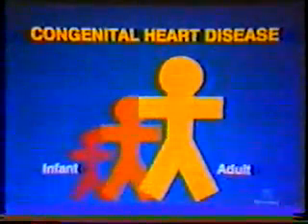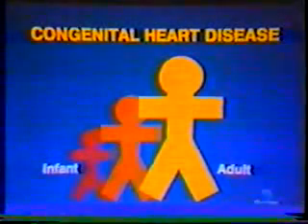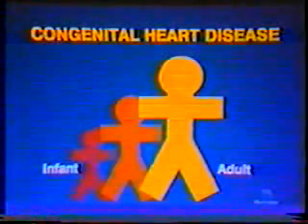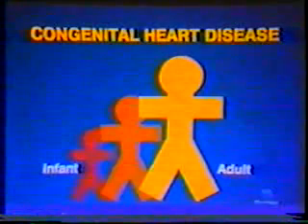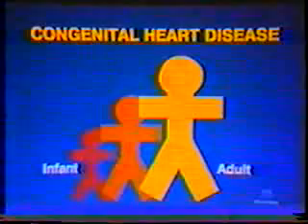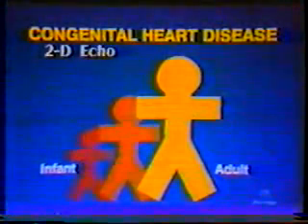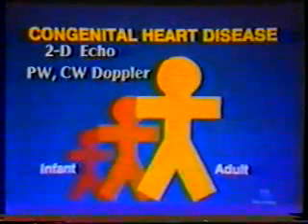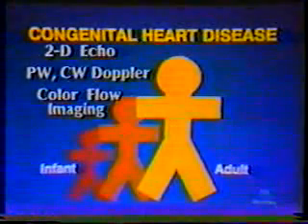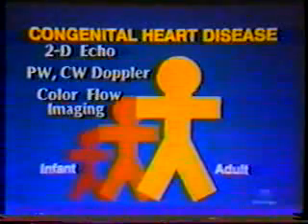Since echocardiography plays a vital role in the complete assessment of these patients, it is crucial that the adult cardiologist be thoroughly familiar with the echocardiographic features of various congenital lesions. In this tape, we will present and discuss the role of two-dimensional echo, pulsed and continuous wave Doppler, as well as color flow imaging in the diagnosis and hemodynamic assessment of various forms of congenital heart lesions.